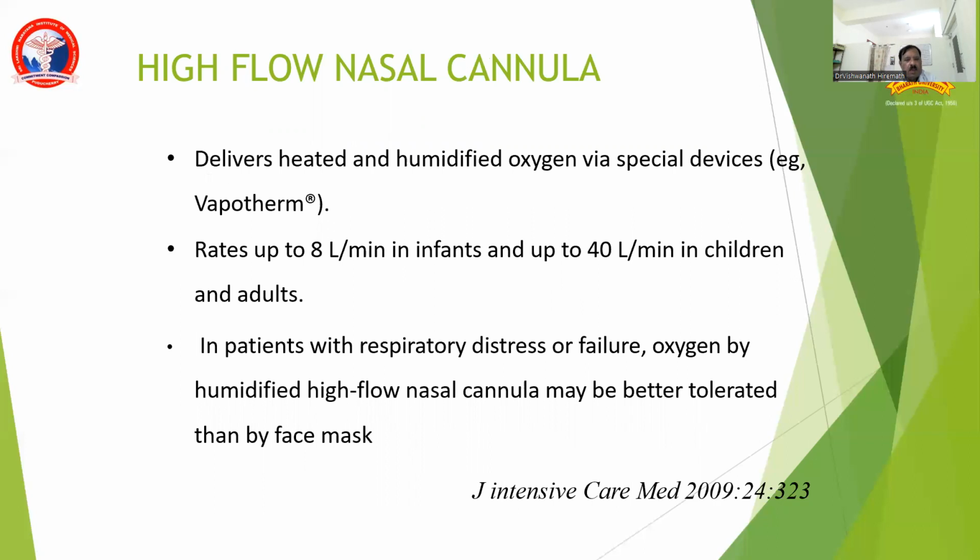If oxygenation cannot be maintained with Venturi devices, then we have to go for high flow nasal cannula or invasive mechanical ventilation.